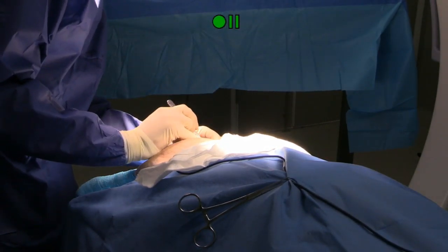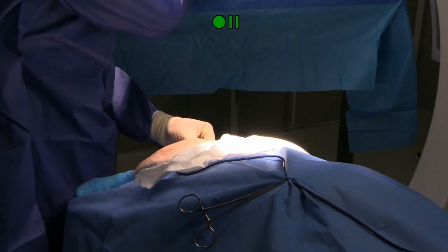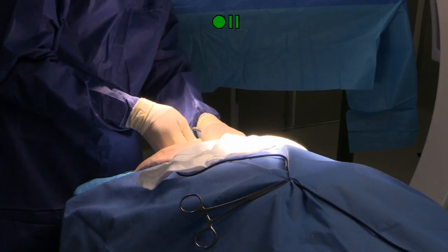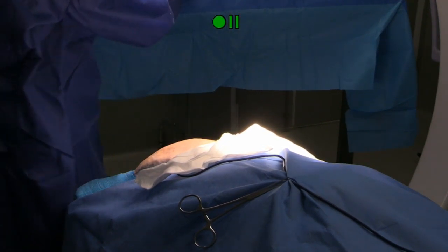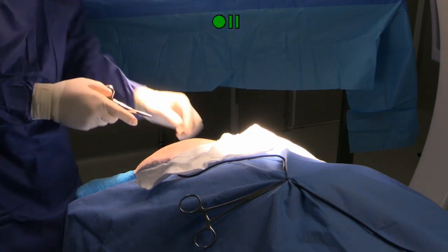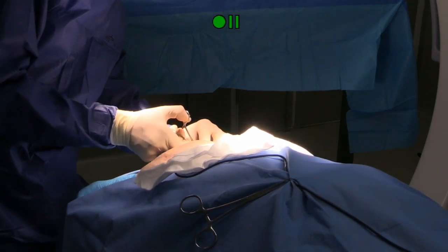One of the challenges with fluoroscopic surgery is to not get your hands in the field. And so we're doing as much as we can to minimize exposure to ourselves with the radiation source. It's always a little bit easier said than done, grabbing on the ischium.